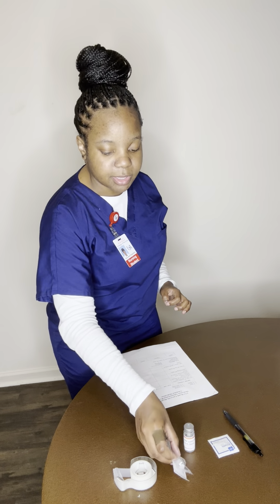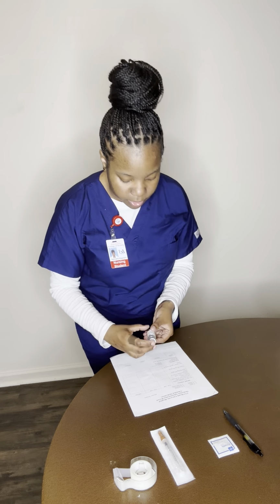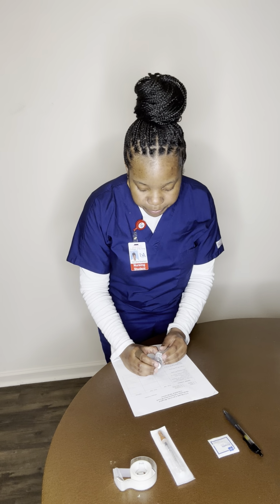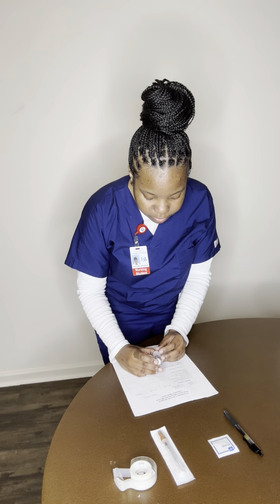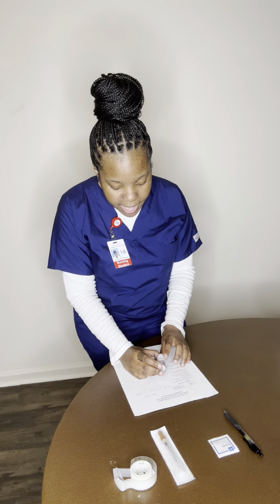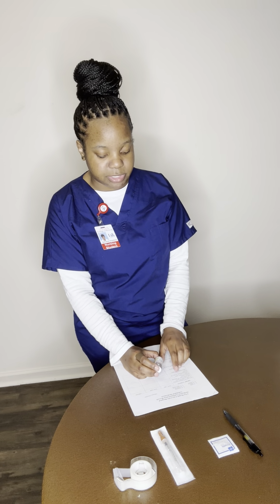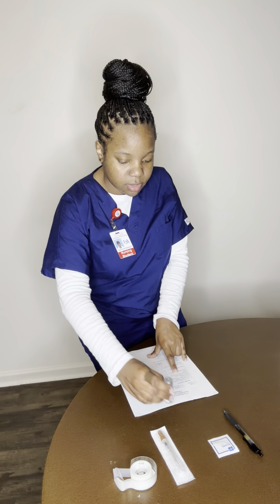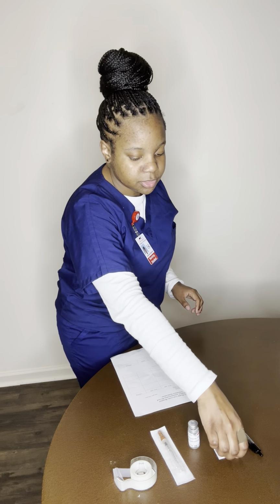So now I am going to check for the right dose. So I'm going to calculate the dose. So like I said, it's heparin, 5,000 units subcutaneously every 12 hours. And this is heparin, 10,000 units per milliliter. And so we know that 5,000 units is half of 10,000 units. So half of 1 milliliter would be 0.5 milliliters. So now I'm going to clean my vial using the alcohol pad.